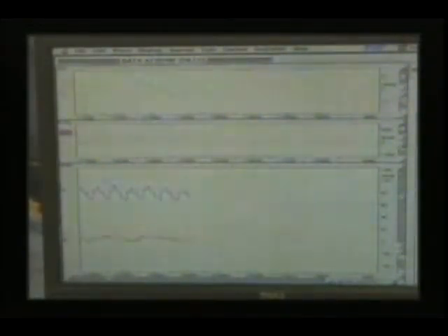Over the course of the bleed, we'll observe the aortic pressure, which should decrease, the heart rate, which will increase, and the respiratory rate will also increase to try to compensate a little bit for the blood loss. Pigs and people increase their respiratory rate as well as their tidal volume and depth of respiration to try to naturally compensate for the loss of blood.